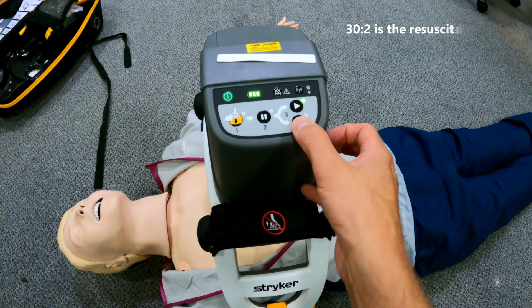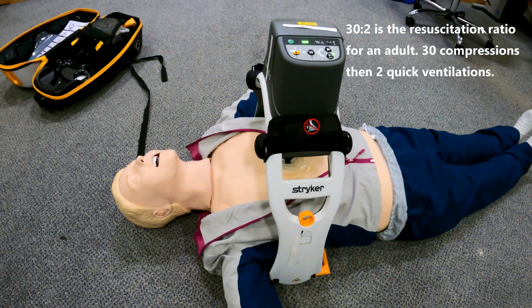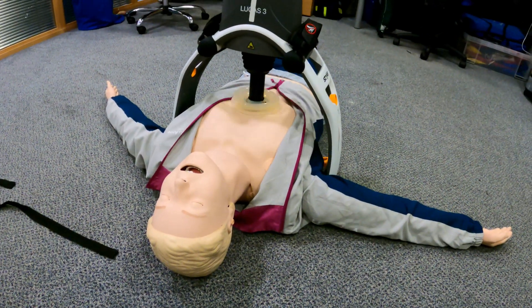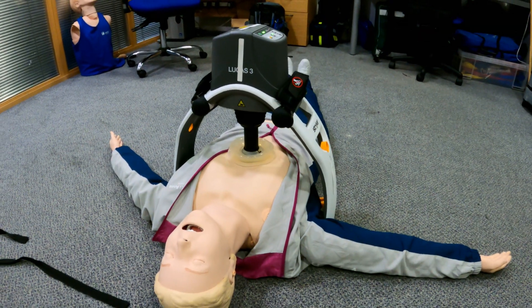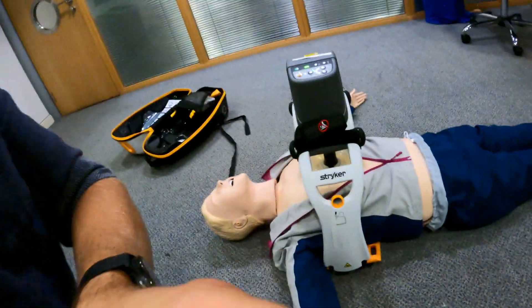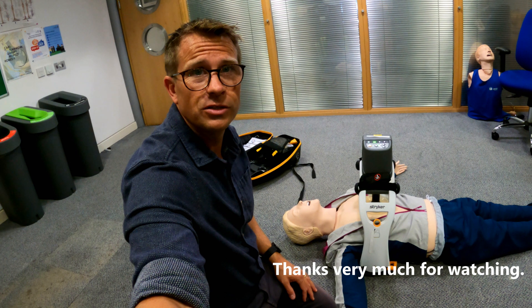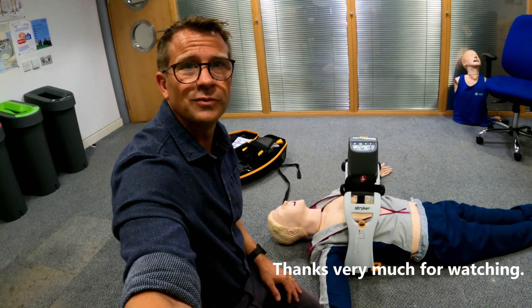At the moment I've set it to continuous so it'll just keep going. You can also tell it to do 30:2 — with the ALS algorithm it will pause to allow you to do ventilations if needed. It's a really useful bit of kit and can save a lot of workload if there's not many of you on the job. That's the Lucas 3 chest compression device. If you've got any questions, pop them in the comments below, and if you want to see anything else, let me know. Thanks very much, bye.